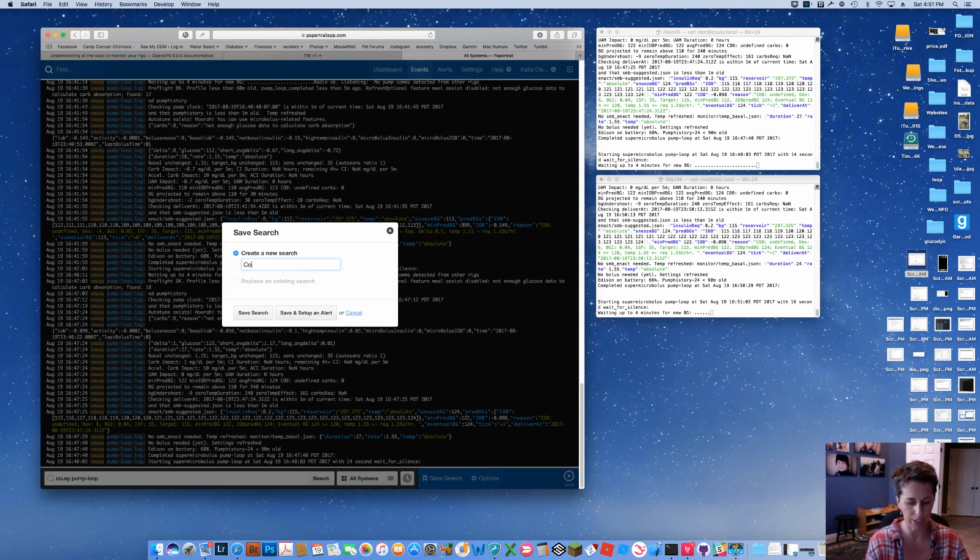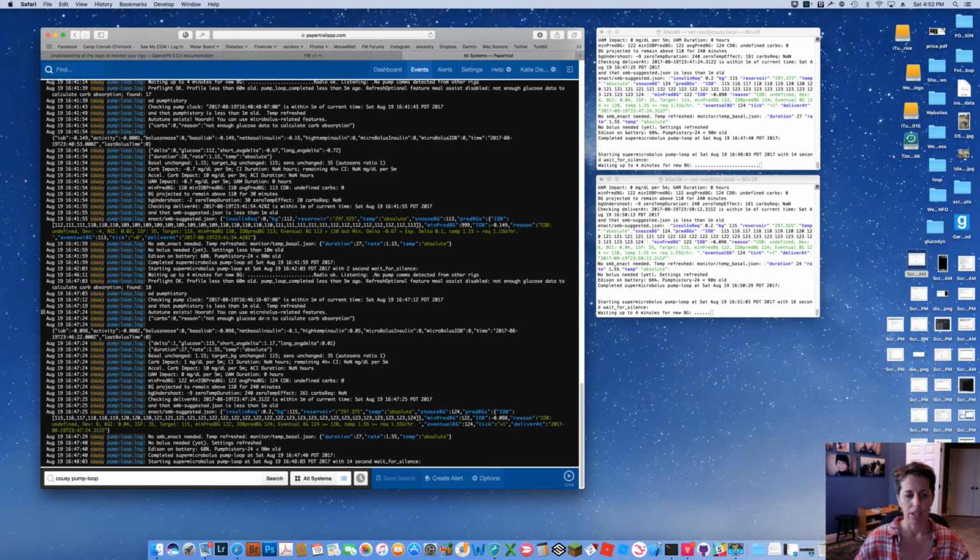Call it a new search. Call it your rig's name and pump, perhaps. That's just an idea. You can call it whatever you want. You save the search. So that's super helpful.